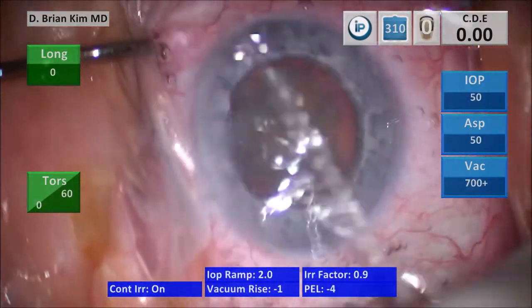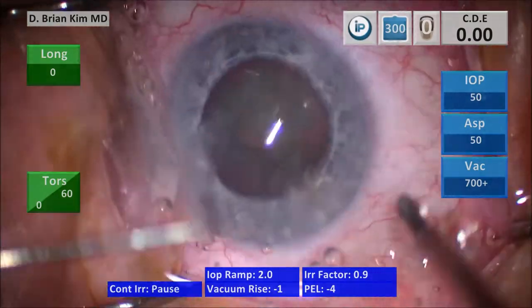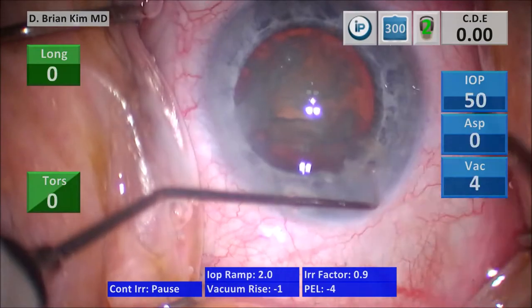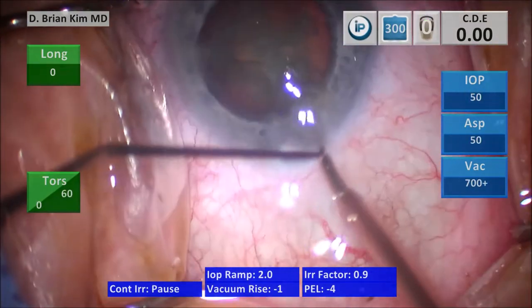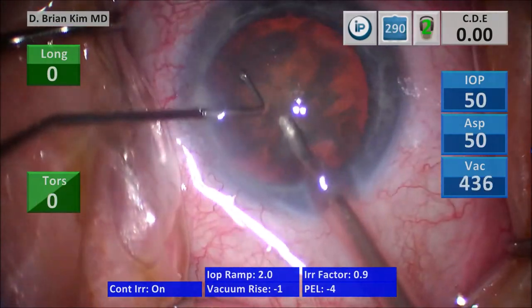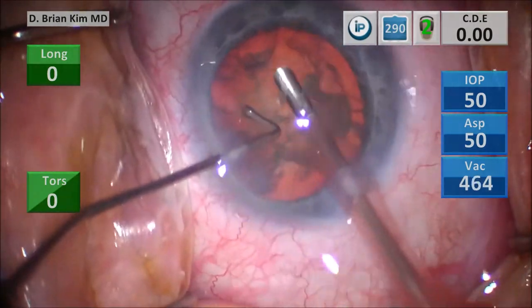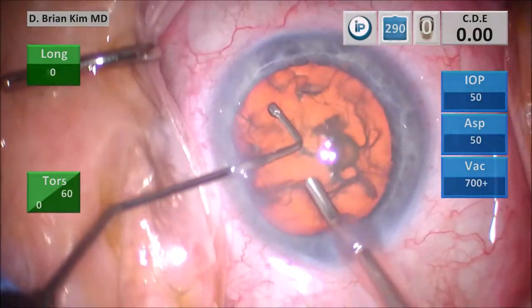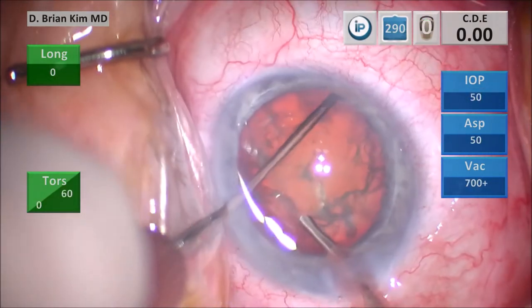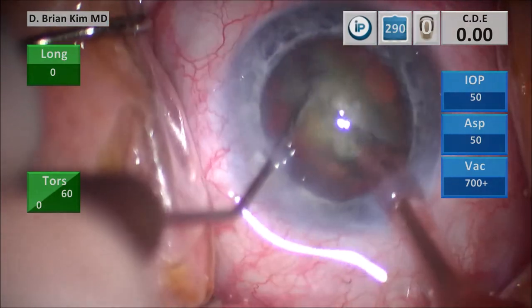Irrigating the surface of the cornea, especially since there was a lot of oily material at the beginning of the case — I'm removing a lot of oil there with profuse irrigation during this step; I don't want that oil to get into the eye. I'm lifting the incision with the chopper, going in with irrigation off to minimize Descemet's trauma, removing the surface epinuclear material, placing the chopper underneath the epinuclear ridge, sliding it out into the equator, pointing the phaco tip vertically sub-incisionally, bringing the instruments together in the same plane, crushing the lens in half. That's the double chop.